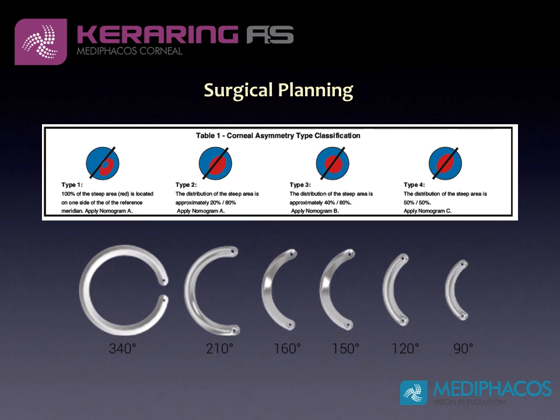Surgical planning for Keraring AS employs a similar procedure as the one used for the standard Keraring. The Mediphacos nomogram suggests classification of the keratoconus according to the degree of corneal asymmetry in relation to a reference meridian. The reference meridian can be either the topographic or refractive steep meridian or the coma axis, depending on the treatment strategy.